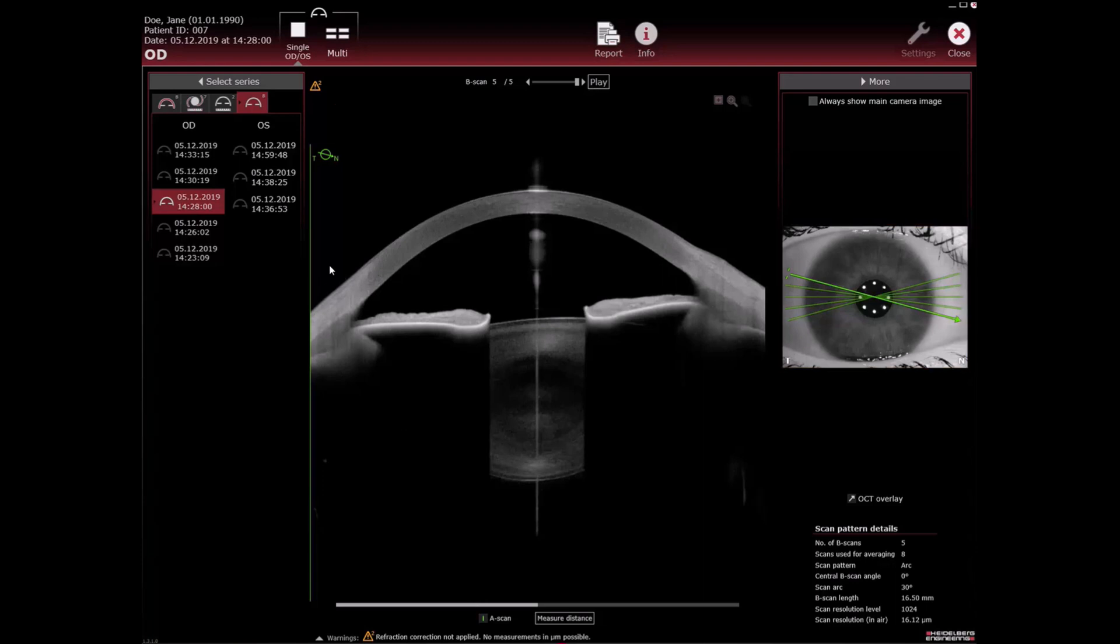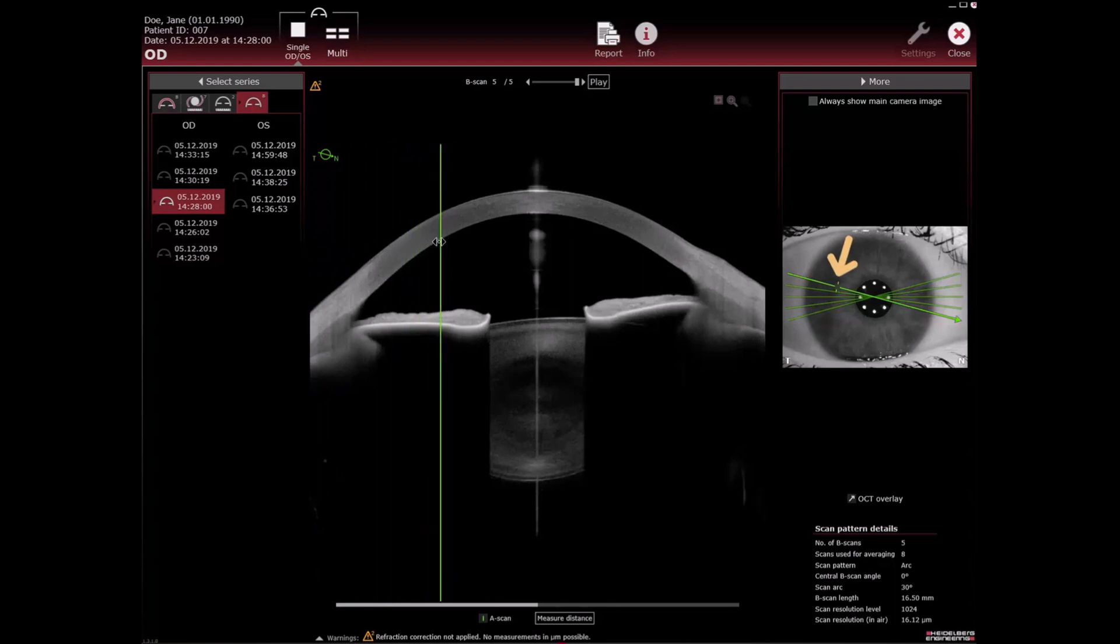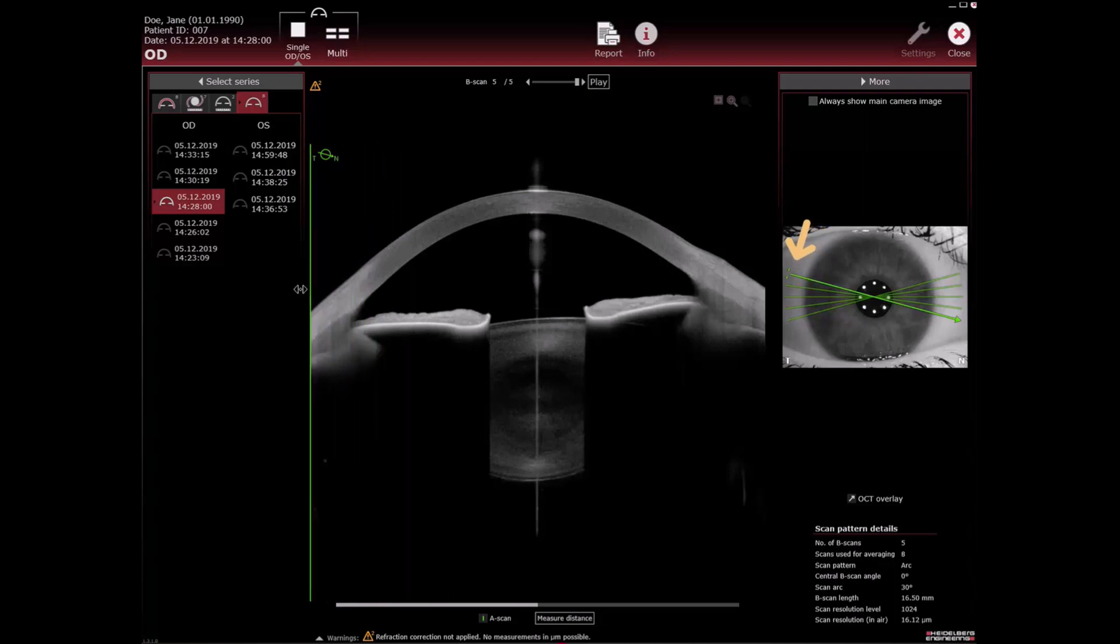When you move the A scan line on the OCT section image, the position of the A scan in the B scan line moves accordingly on the camera image.